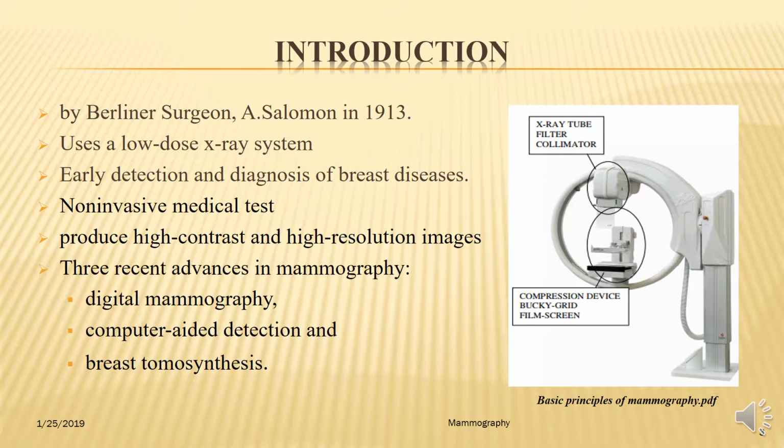These systems are similar to those found in digital cameras, and their efficiency enables better pictures with a low radiation dose. These images of the breast are transferred to a computer for review by radiologists and for long-term storage. The patient's experience during a digital mammogram is similar to having a conventional film mammogram.